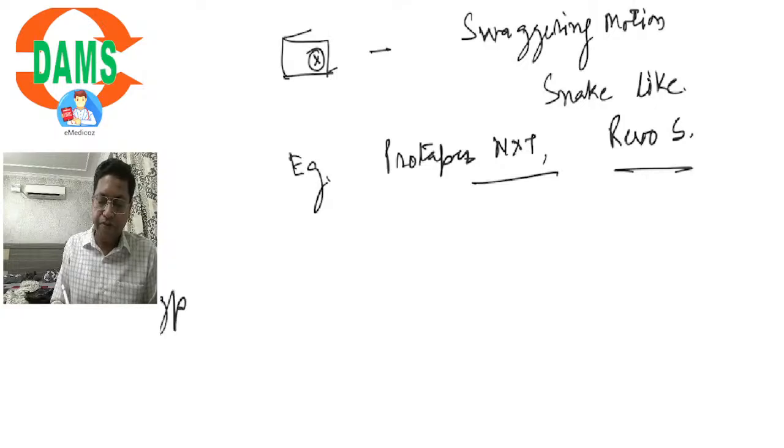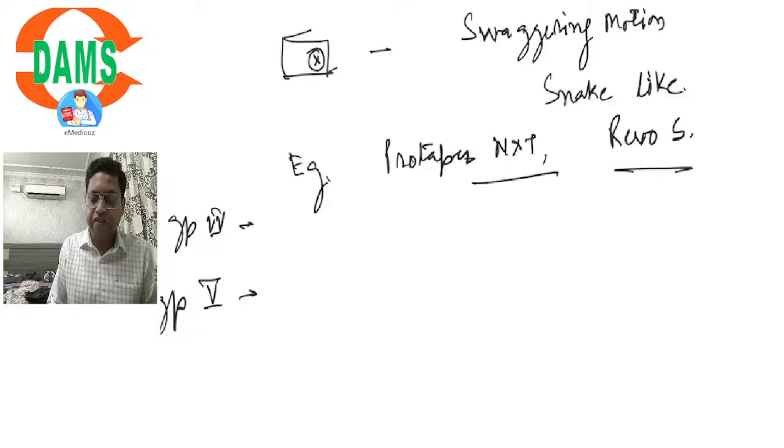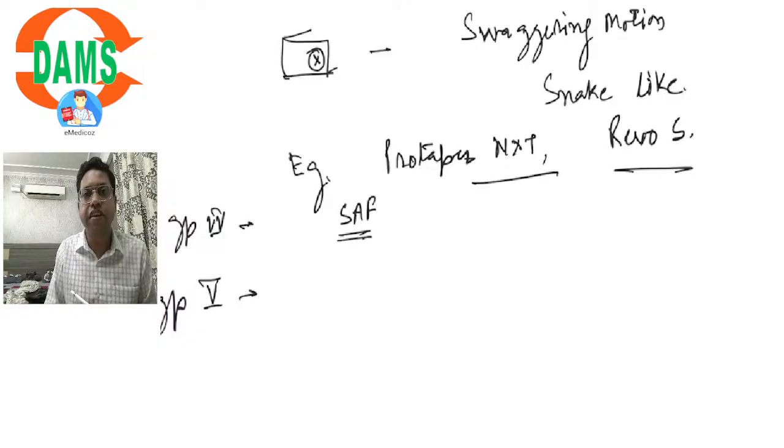Now we talk about group 5 instruments. I am skipping group 4 because group 4 consists of three-dimensionally adapting instrument, that is the self-adjusting file, that we have already seen in the above examples.